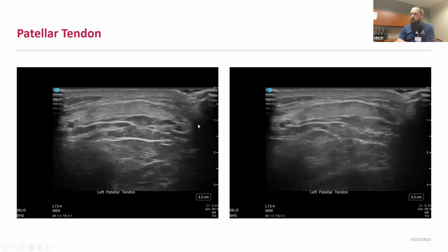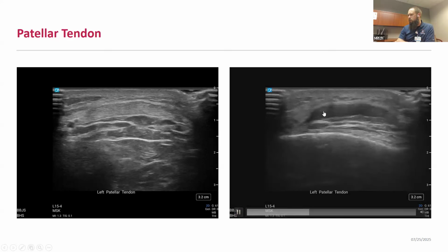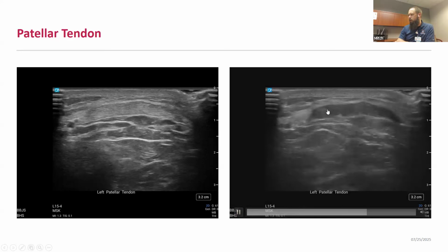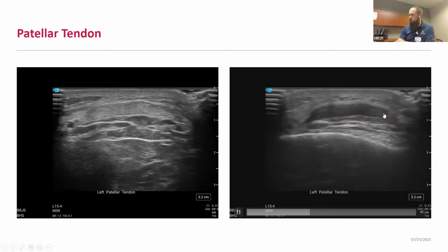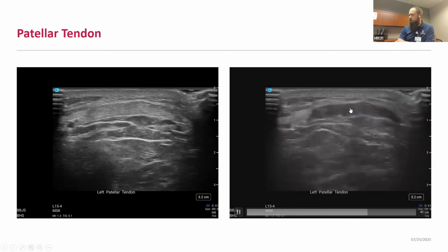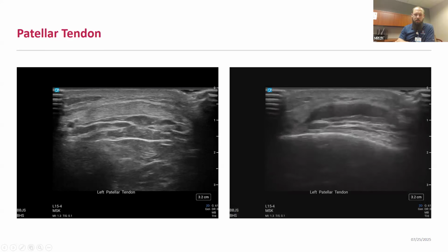And then looking at the patellar tendon in short axis, you're able to evaluate the full width of the tendon. You see some of your medial patellar retinaculum coming off of here. I lose some of that here on that lateral side, just from the probe floating off of the knee. And then again, evaluating tendons, be wary of anisotropy. I'm toggling the probe cranial to caudal here. Depending on the positioning of your probe, you'll be able to bring that tendon into good view versus more of that hypoechoic appearance of the tendon.